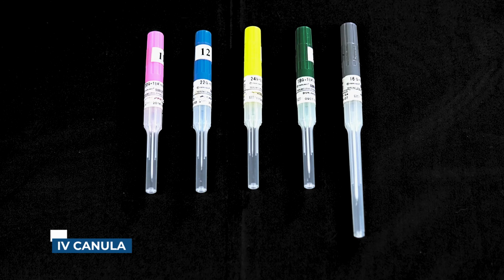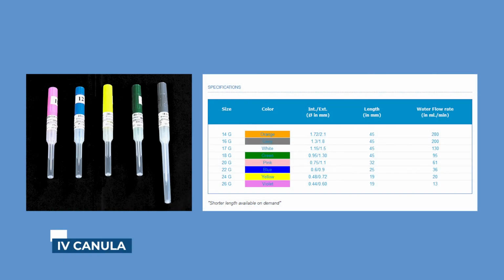Cannula is a tube that can be inserted into the body, often used for delivering fluid. IV cannula connects the infusion set and the vessels. Cannulae normally come with a trocar attached, which allows puncturing of the body in order to get into the intended space. Once the trocar is removed, the cannula becomes a flexible tube. Different cannula sizes are indicated by different colors. This table shows the color coding of IV cannulas along with the gauge size and maximal flow rate. This color coding makes them easier to differentiate, especially in emergency situations in which size might be critical.